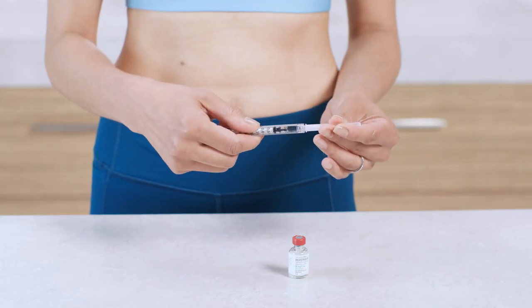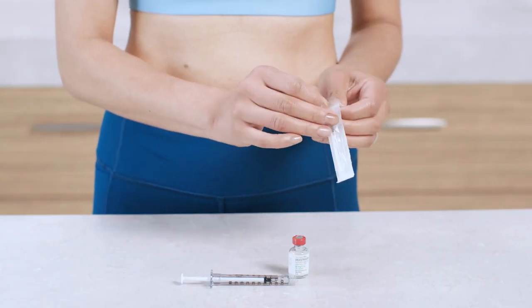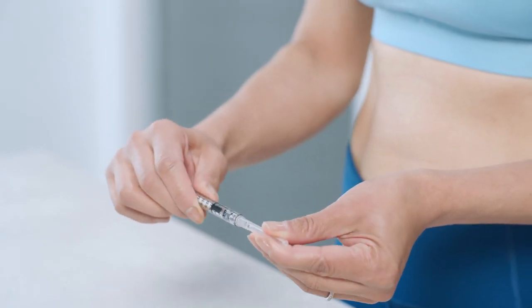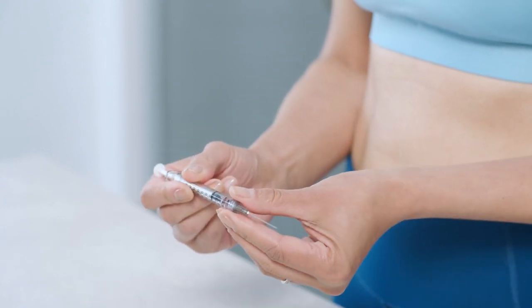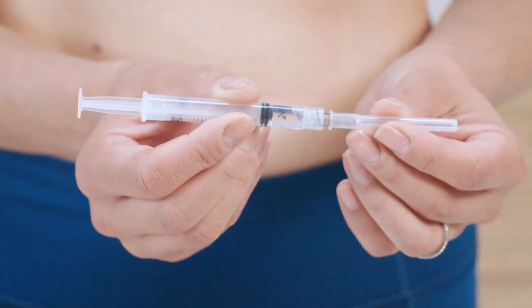Now you're ready to switch needles. Twist the drawing needle off the syringe and toss it into the sharps container. Then remove the wrapper from the long injection needle, twist that needle onto the syringe, and pull off the needle cap. Point the needle up and tap or flick the syringe to remove any air bubbles until they rise to the top. Then press the plunger slightly until a tiny droplet of medication appears at the tip of the needle — a droplet is a good thing, it means your medication is ready to go. Recap the injection needle and set it aside.